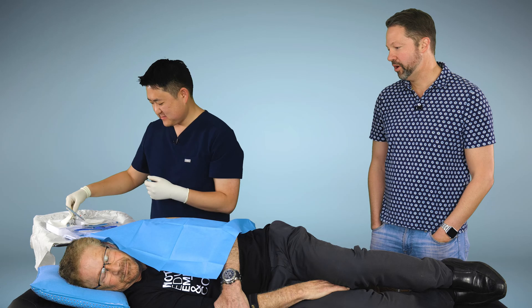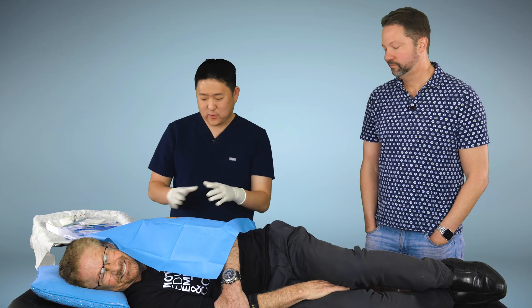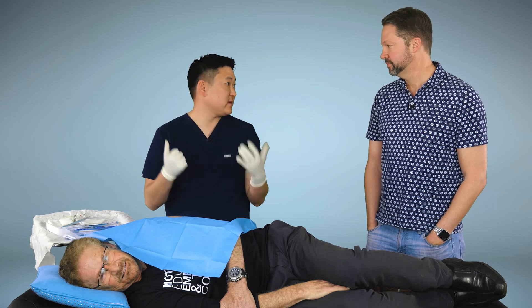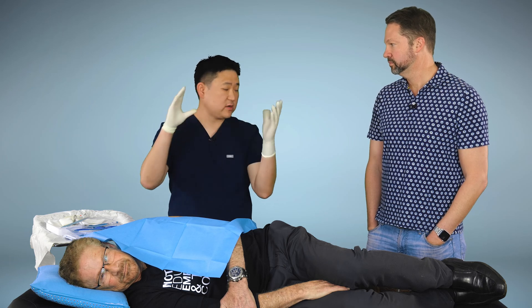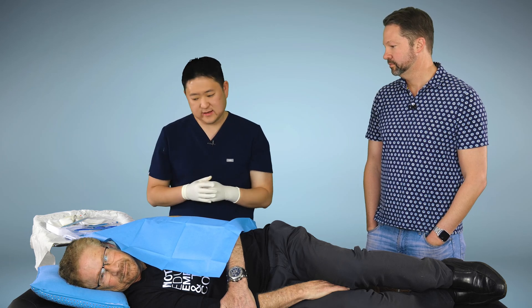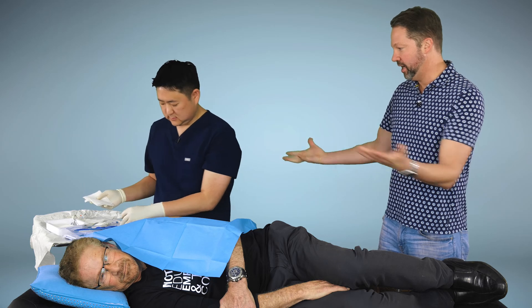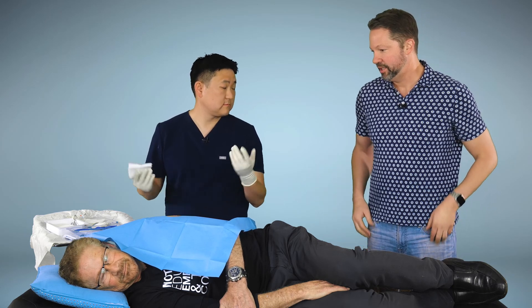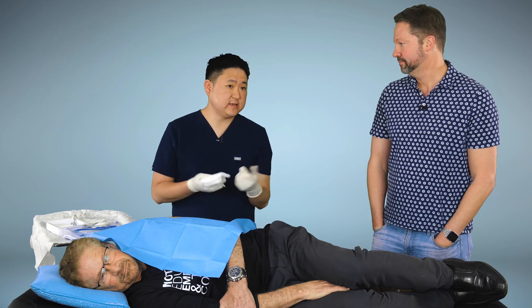Is it a problem when people have bulging biceps? That's a good question. As you can see, Steve is quite muscular. I've done it on patients with quite big muscles — there are always little crevices between the deltoid where you can put it in, so I've put it in on some pretty buff guys. And as you can see, this is something you can do in a very common office room; there's not a whole lot of setup required. The room I use in my office is actually the same room I see patients in — most exam rooms already have an exam table.